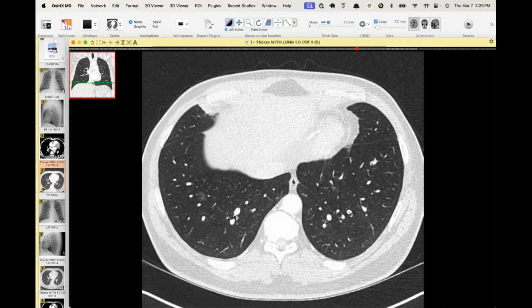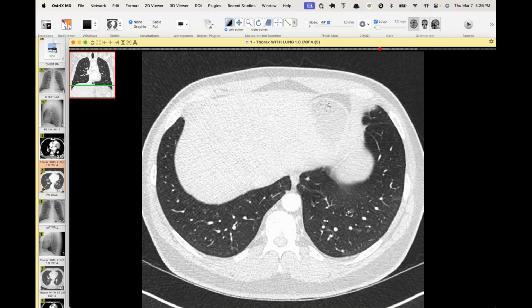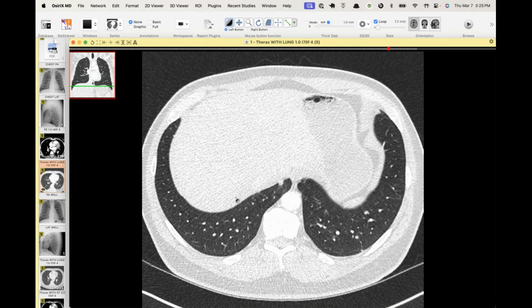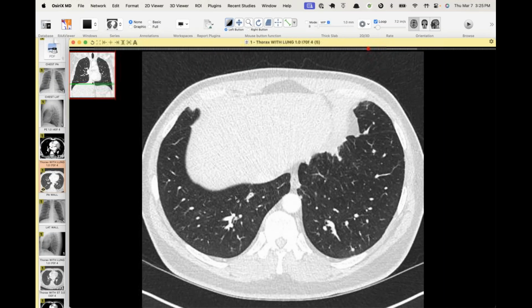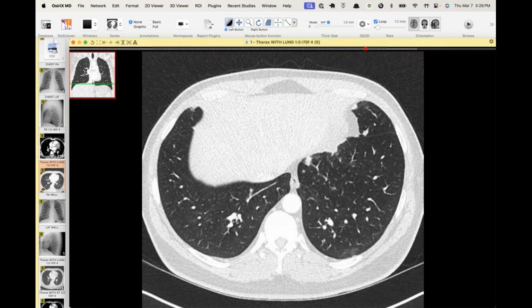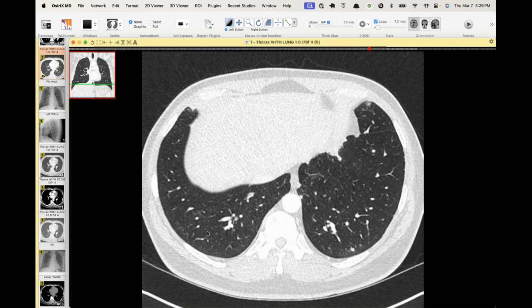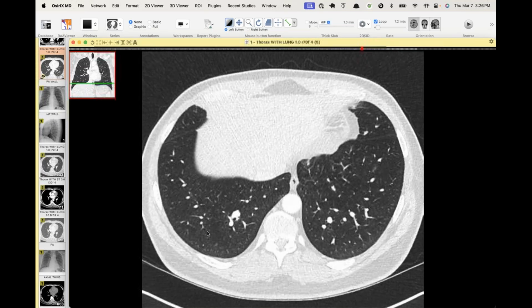But I've looked at a couple case reports, and you can find some that have similar looking stuff. Again, that's why I'm showing it as presumptive, but certainly not confirmed. And I don't think they're going to go back and pull the path. I may ask the pathologist, because the pulmonologist that just sent this to me, FYI, that things had gotten better with his antibiotics. So it was the CSF where they made the diagnosis? Yep. So he definitely has neurosyphilis, and then this is just presumed secondary lung involvement.